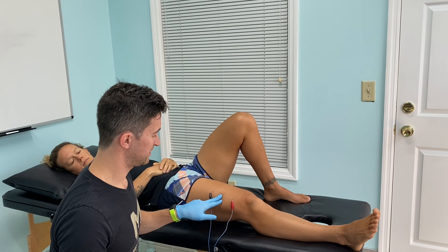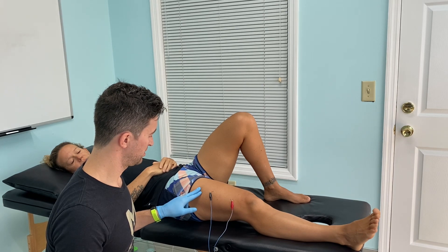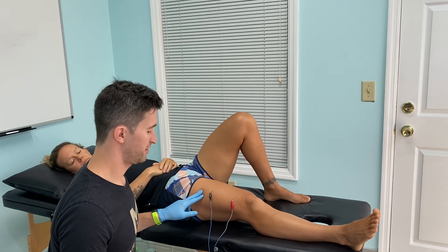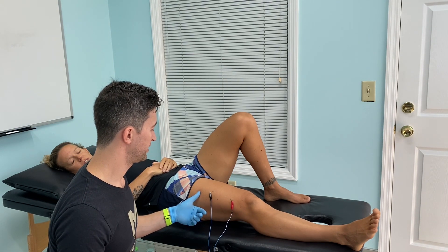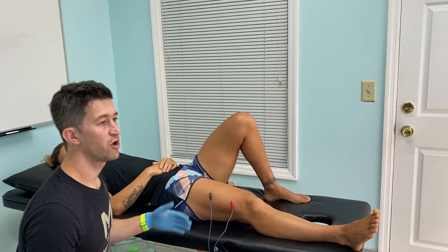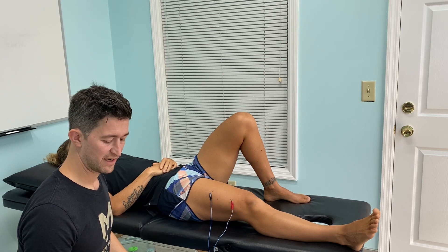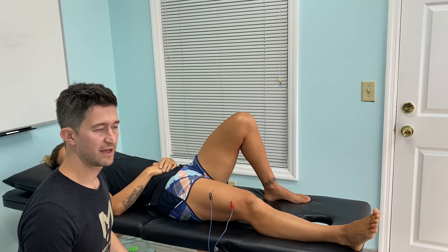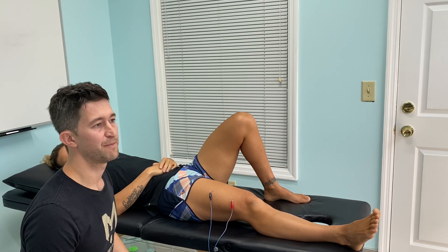We'll turn this on and wait to see if we can start to get that jump — and we can start to see it there. How strong? I usually like to get a moderate to strong but comfortable level. If it starts to get uncomfortable we'll turn it down; it shouldn't be painful. We've got a nice little jump there. Usually we'll alternate between this and then get a faster jumping. I'll leave it for about a minute, but just for the video we'll turn it up a little quicker for a faster twitch, and then back down. That alternating current is what helps reset the pain signal going up to the brain.